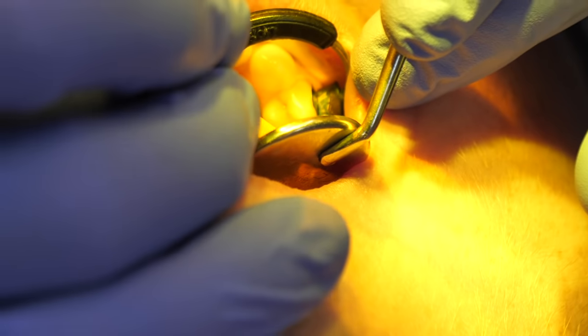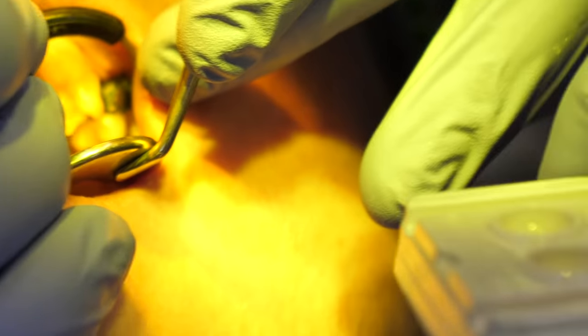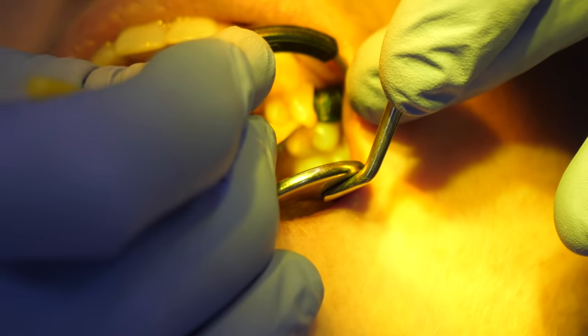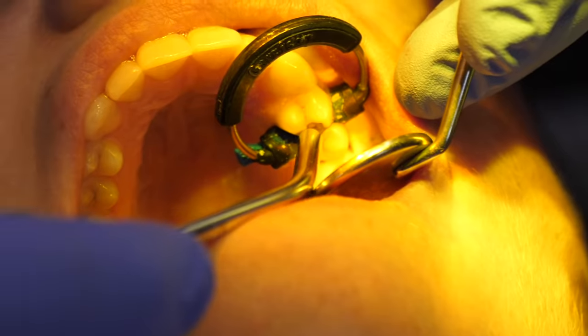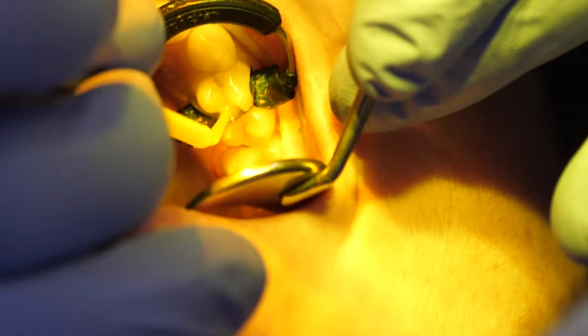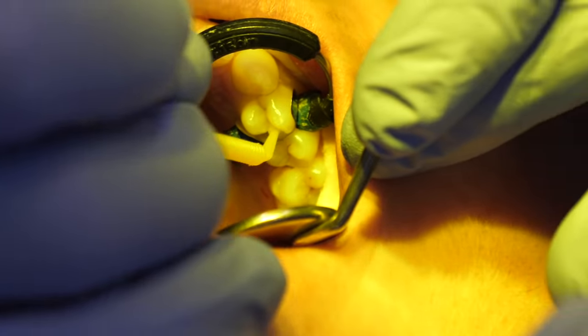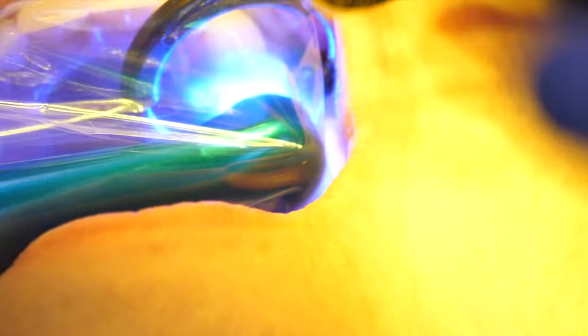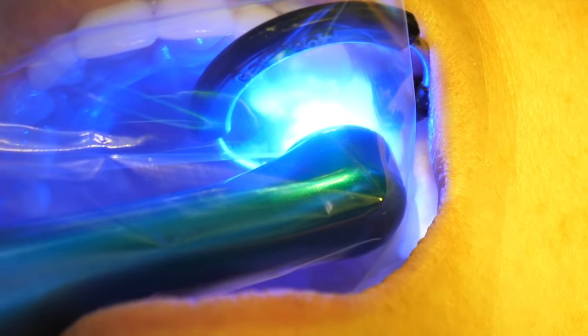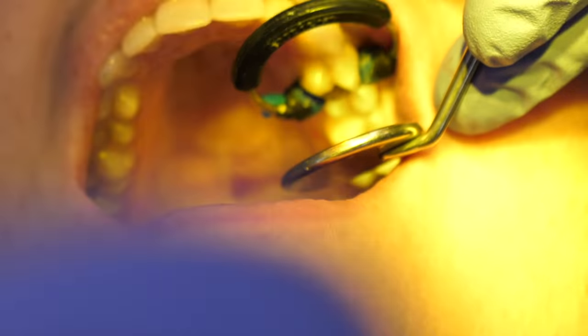This type of filling, the composite resin filling, is applied in layers. So right now what you're watching is the first step of the bonding agent where they brush it on to etch and prime the tooth. The next step is the adhesive, which is light cured. After brushing it on, they will use the special light to harden it. Now the tooth is one step closer to being ready for the tooth-colored filling.